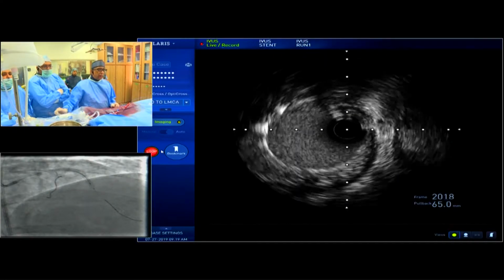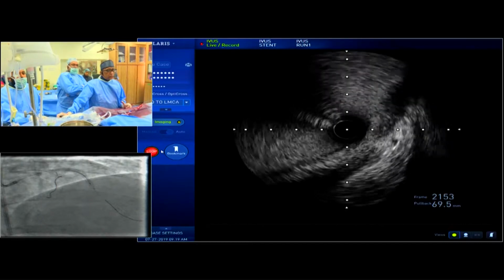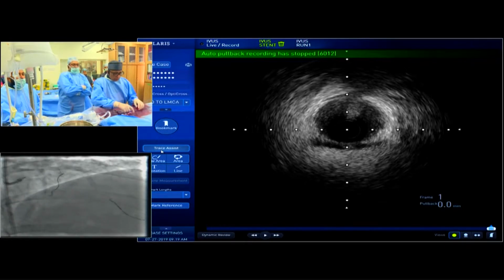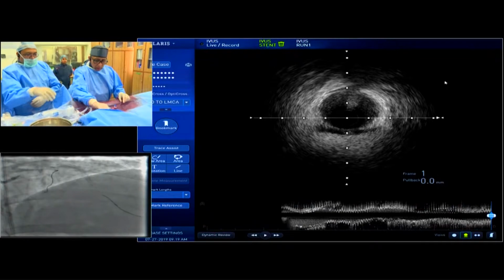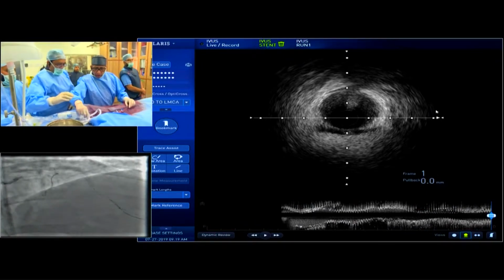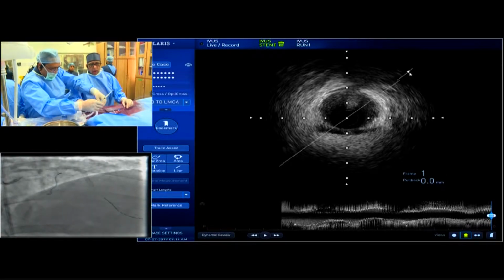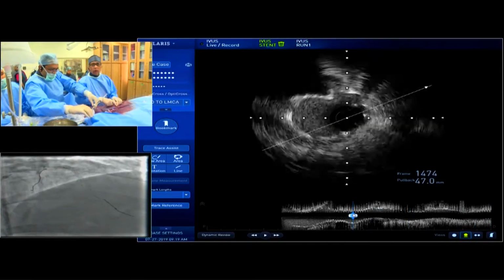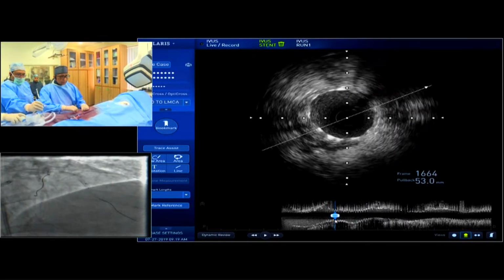Yes, that's right. This is the part of LMC, right? Yeah. So this is one part. Now I go to the... Shuvanan, can you tell what is the ostial part of this LAD? Area, ostial LAD. What is the area you achieved? Can you show again? IVUS. Yeah, I'll show you. Don't worry. Ostial LAD, Bhushan, please. Ostial LAD.